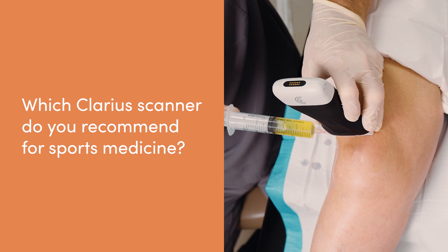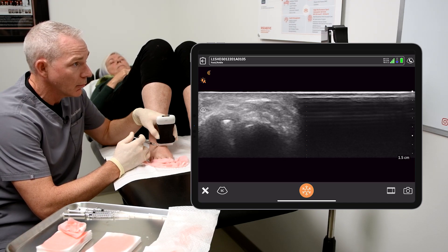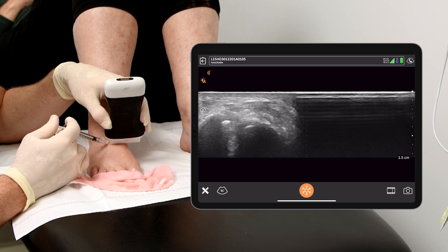The Clarius L15 HD3 is the perfect probe for sports medicine. It can see the first two and a half to three centimeters exceptionally well. There are other machines on the market that we'd call an all-in-one that can be everything to everybody, but we all know that's a fantasy. The L15 HD3 is perfect for sports medicine.